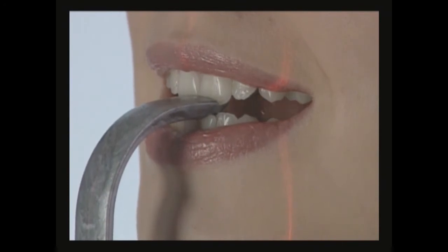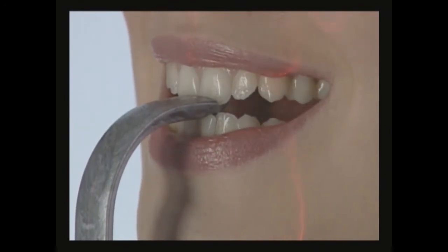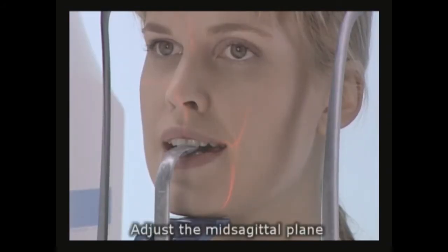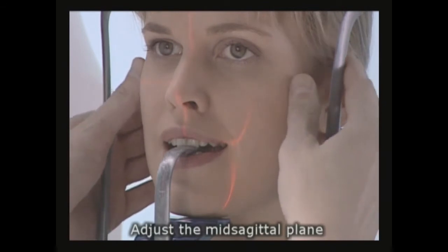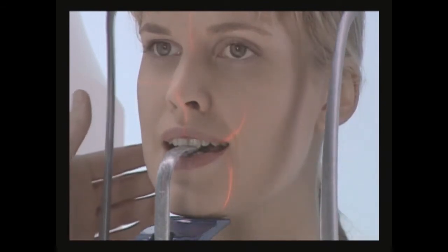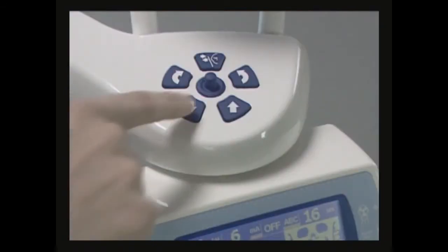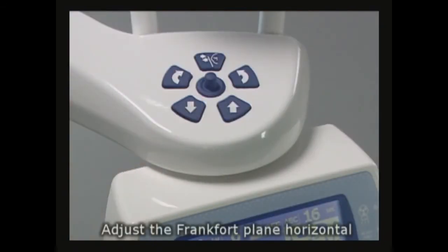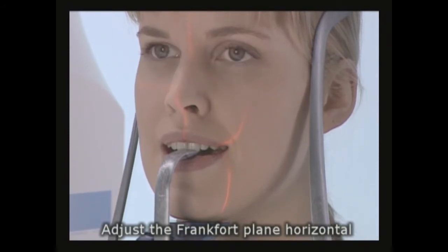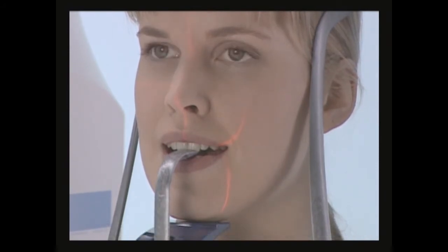The incisal edges of the upper and lower teeth must be in the groove in the bite piece. Turn on the positioning lights and position the patient's mid-sagittal plane. Close the temple supports. By adjusting the height of the unit, set the patient's Frankfurt plane to coincide with the positioning light. Make sure that her back and neck are straight, shoulders level, and the neck muscles relaxed.